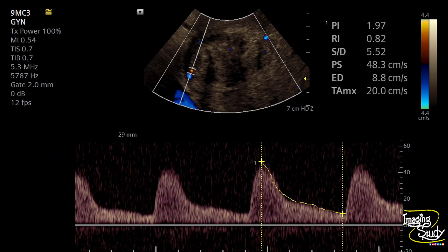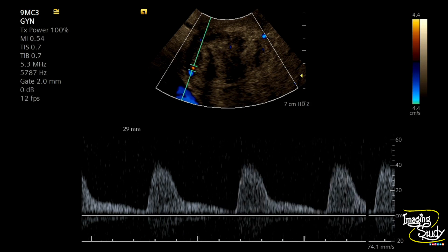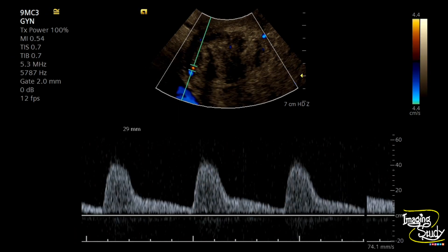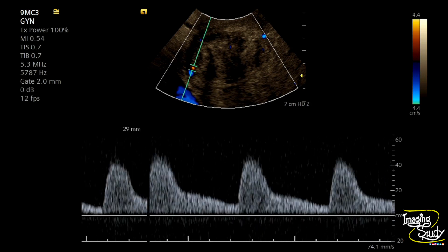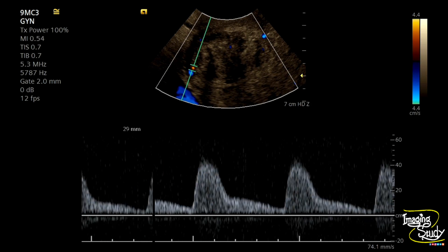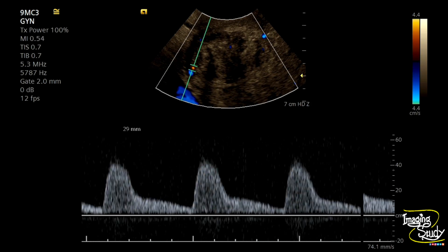We have measured the resistive index and it was around 0.8. If you checked my previous case videos with Doppler findings of fibroid uterus, you know that fibroids usually get moderate resistant flow — like 0.5 to 0.6 resistive index. But here it is 0.8. This patient is 50 years old, in a perimenopausal state, and as these fibroids are getting degenerative changes, the peripheral resistance is increasing. The vessels are giving a change from moderate to high resistance flow. So possibly these fibroids won't get enlarged in size — rather they will get atrophied in future.